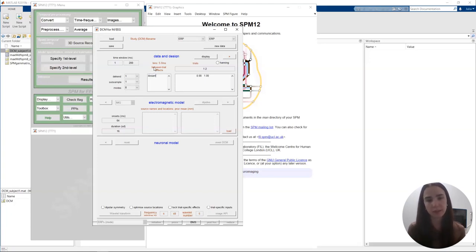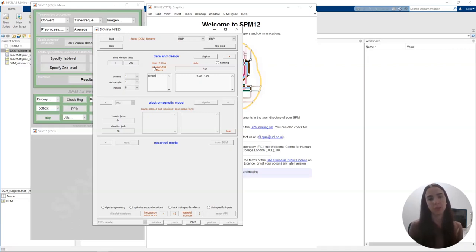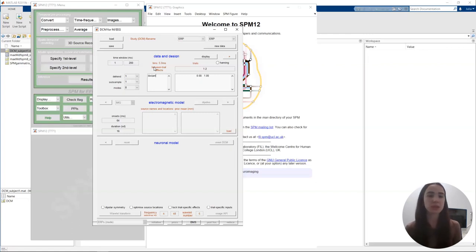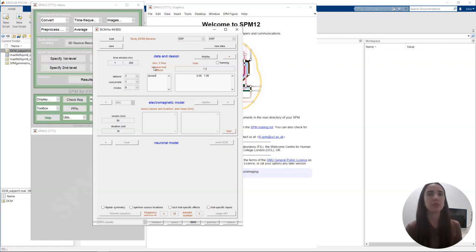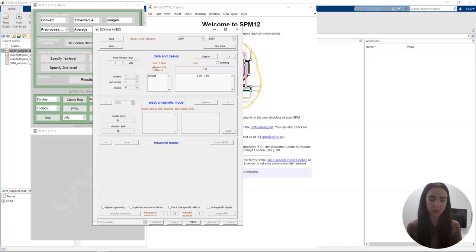Here we're going to specify our between-trial effects. We have two conditions: standard and deviant tones. I'm going to code the between-trial effects as zero for the baseline (standard tones) and one for the modulation (deviant tones), and give it the name 'deviant'. The between-trial effects could also be coded as minus one and one for paradigms where there's no clear baseline — for example, comparing responses to houses versus faces. In that case the extrinsic connectivity matrix A (the background connectivity) becomes the average between the two conditions.